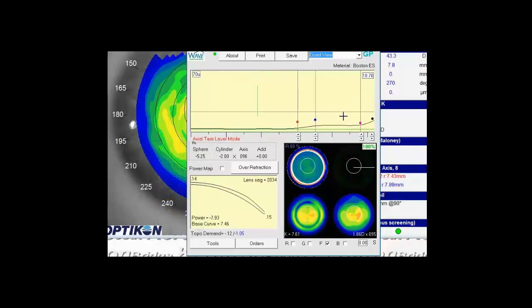And if we're dealing with edge lift, we want to decrease edge lift. We can drag the pink dot down. And conversely, if the edge looked tight, we can drag the pink dot up. And that's how we can control and adjust the back curvature of the contact lens.